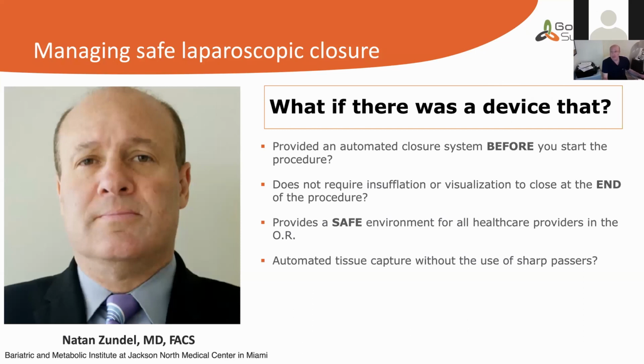Most of the aerosolization in laparoscopy comes from energy and from the CO2 coming from inside either the abdomen or the chest of the patient. So we need to prevent being exposed to that. All the societies, groups and scientists are giving us some things to do related to that. So let's see first what we were using before this happened.